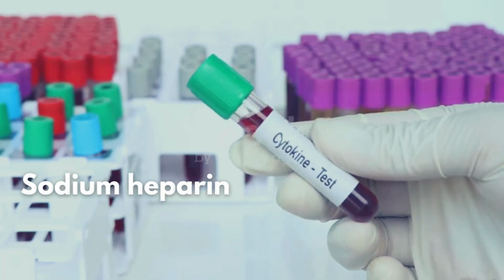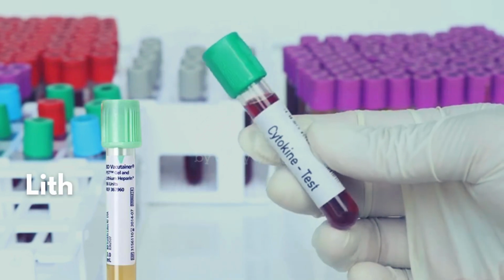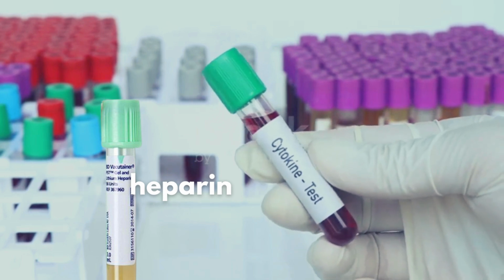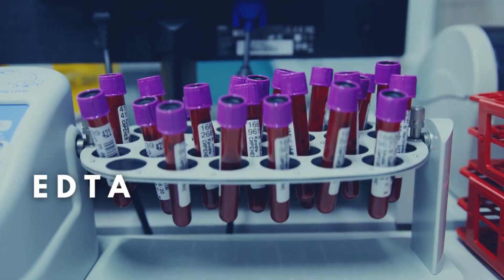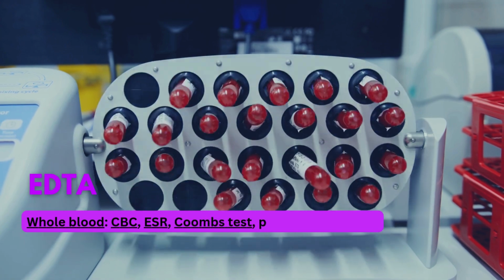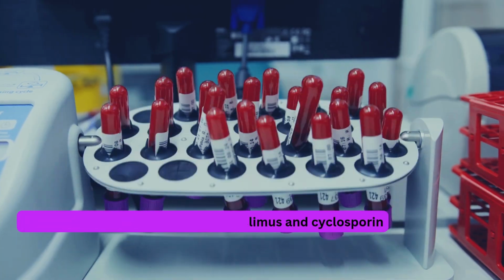Sodium heparin anticoagulant additive is used for chromosome testing, HLA typing, ammonia, lactate. Lithium heparin anticoagulant, plasma separator gel additive is used for plasma. Tube inversions prevent clotting. EDTA, chelator anticoagulant additive is used for whole blood: CBC, ESR, Coombs test, platelet antibodies, flow cytometry, blood levels of tacrolimus and cyclosporin.